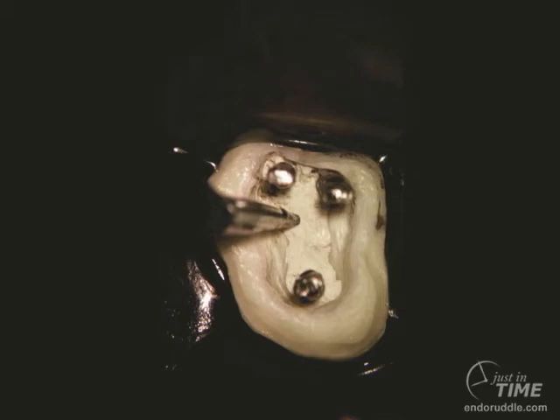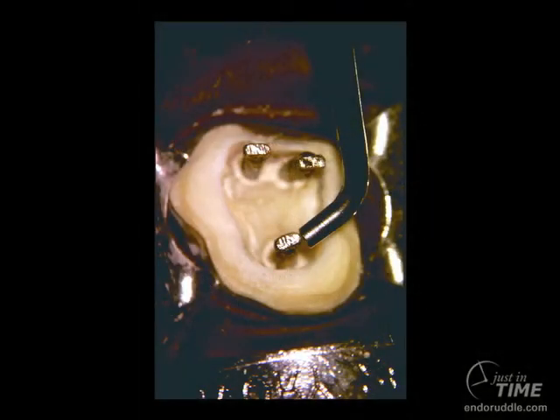We use these instruments at an efficient power that will safely accomplish the clinical task, using a brushing motion to chip out and break out all residual cements. Once the post has been fully exposed, we can begin to think about using a post-removal ultrasonic tip to vibrate against the head of the post.